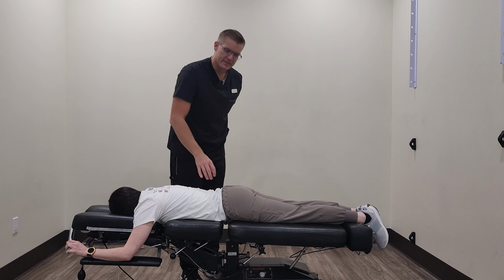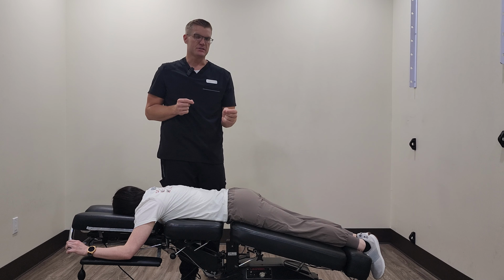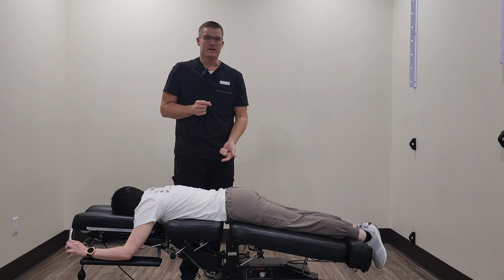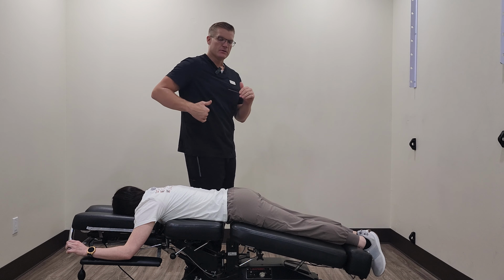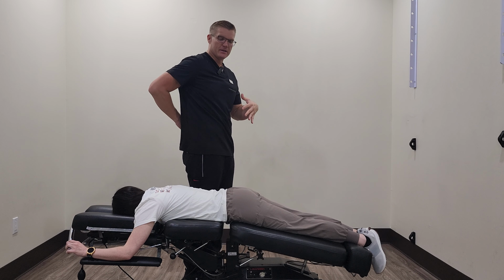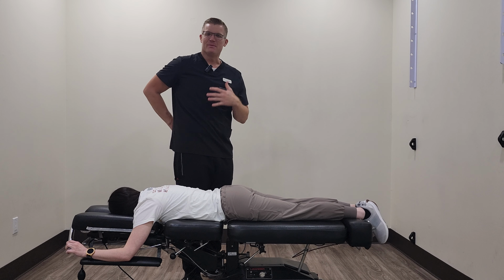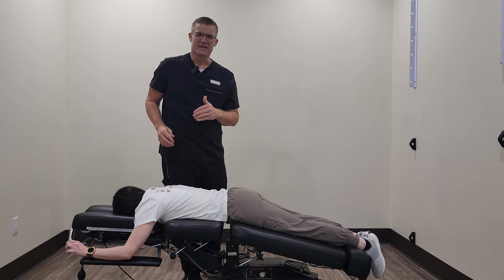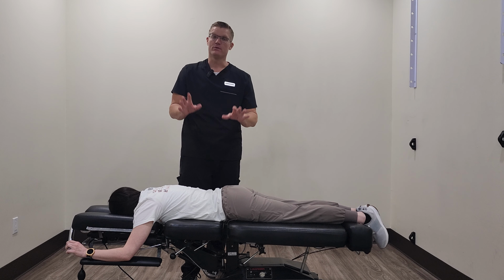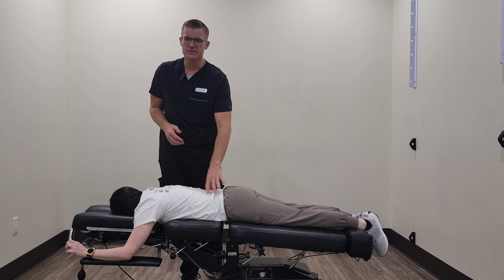This area is very difficult to stretch, and that's why this technique works so good, especially for folks with osteoarthritis of the spine, lumbar spine pain in general, but something called hyperlordosis. So our ladies that have had babies, the spine goes so far forward, baby comes out, you get a new baby, but you get a spine that doesn't function right anymore. And so that's why these techniques can be so beneficial, and they feel really good even when you're in a lot of pain. So this is flexion distraction technique.